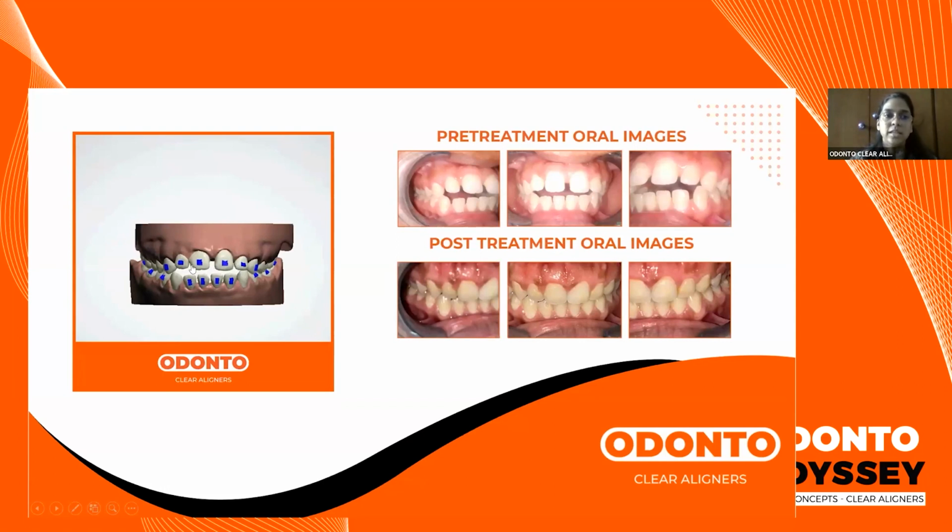So in this case also, you'll see the attachment types are different. The reason is that this open bite is not as severe as the previous open bite, wherein the attachments will be sufficient to bring about bite closure, as we can see in the post pictures over here, wherein there is a good overlap. That is, we have achieved a good overbite.